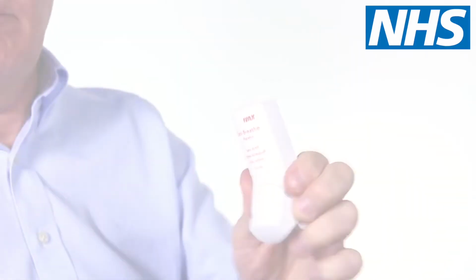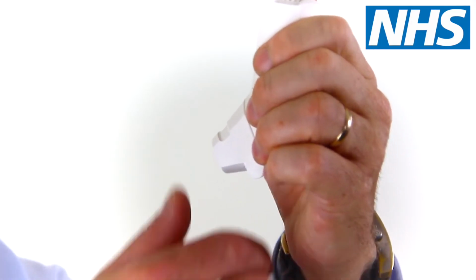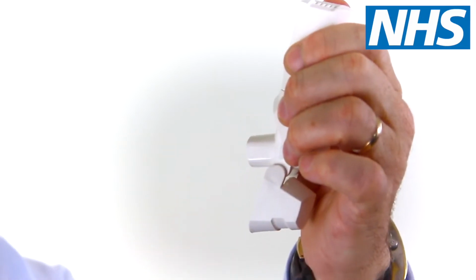You should always sit upright or stand up when using your Easi Breathe inhaler. Shake the inhaler before use. Hold the inhaler upright and with your other hand fold down the cap that covers the mouthpiece. When you're ready, breathe out gently as far as you comfortably can, but not into the mouthpiece.